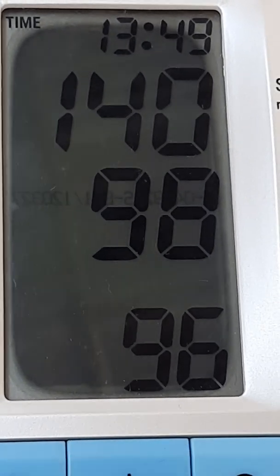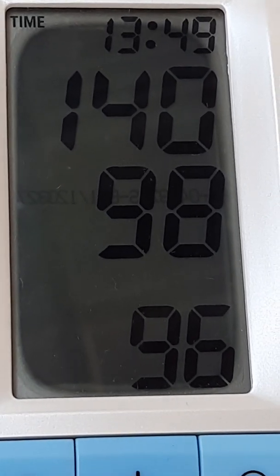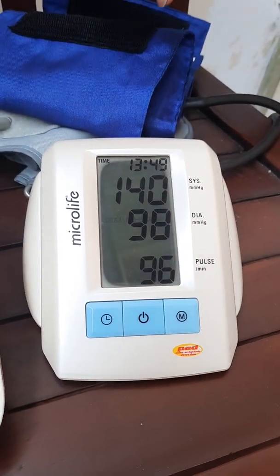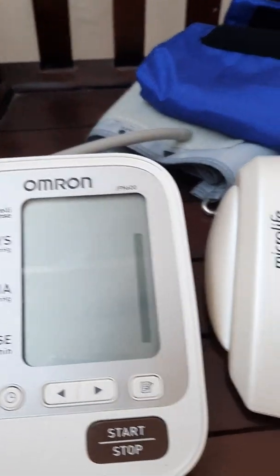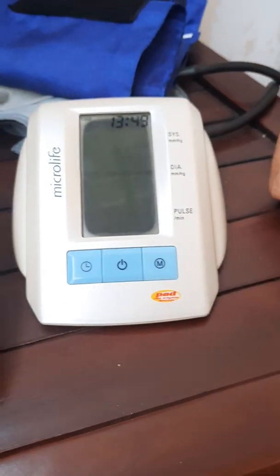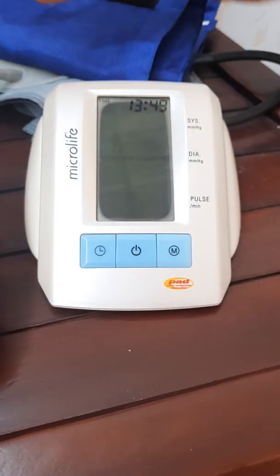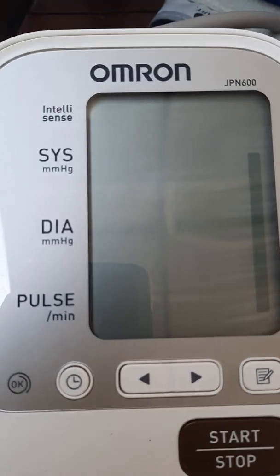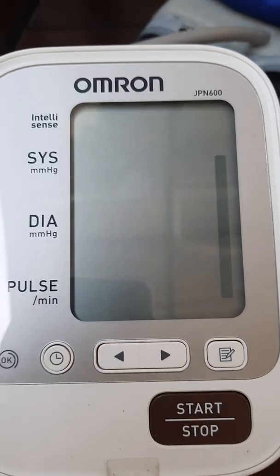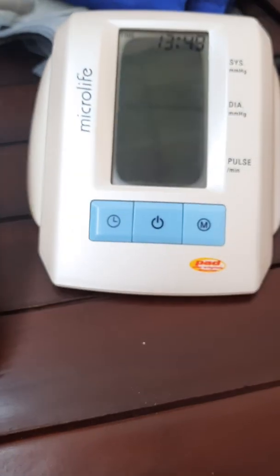140 over 98 — you can see. At roughly the same time, we got two different numbers. So the accurate one is the manual, or the more expensive blood pressure monitor. If you use a very expensive one, then you can get an accurate reading.